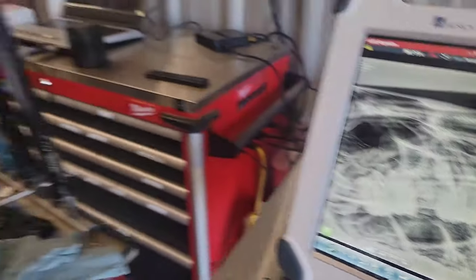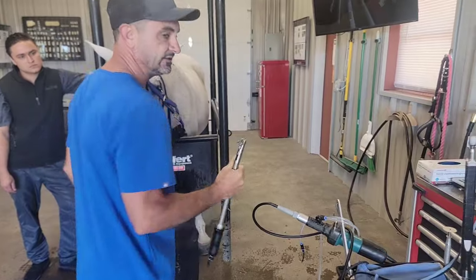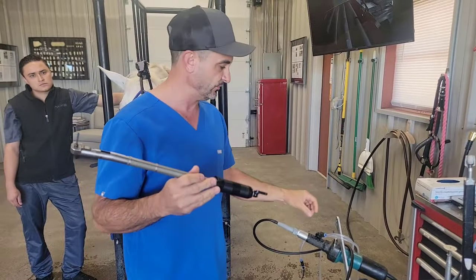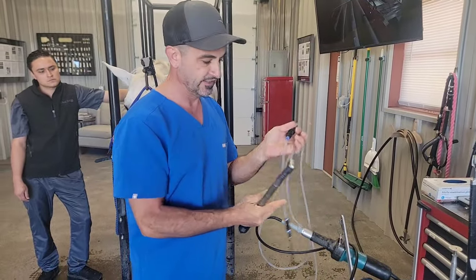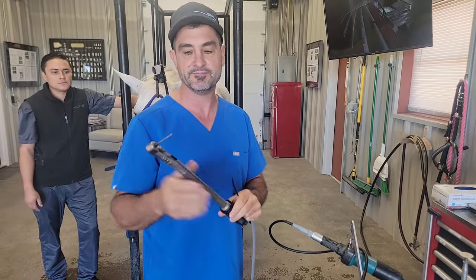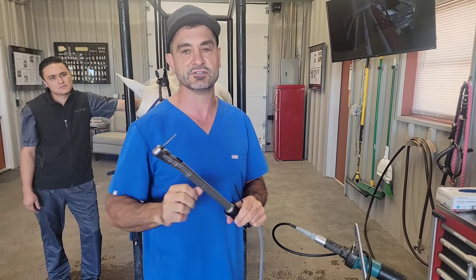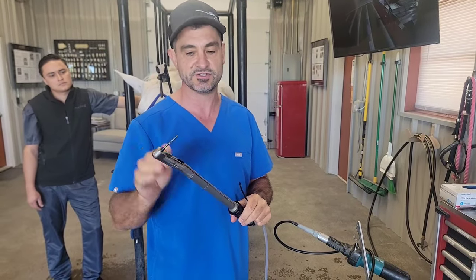What we use is a handpiece from Easy Technik in Germany — a lot of people ask us about that. We also use a water cooling system that keeps the burr clean, and we use burrs from Equine Specialties for sectioning. So what we're going to do is go in and section this tooth.